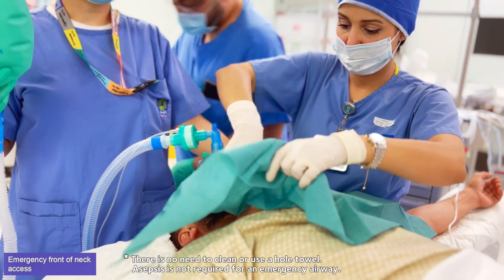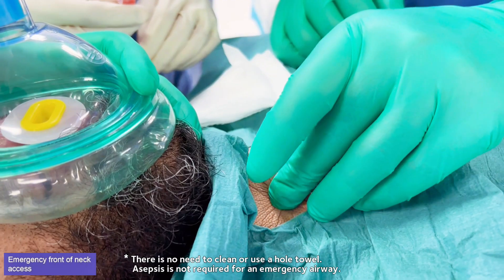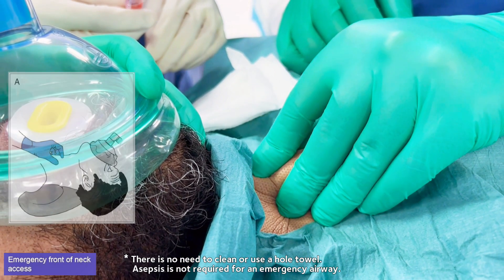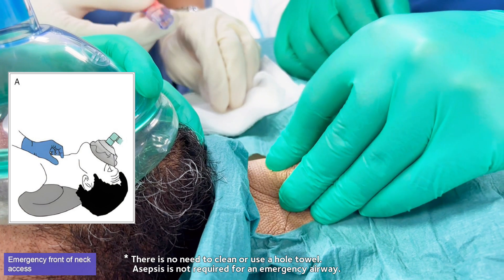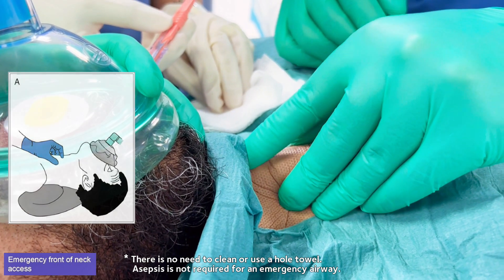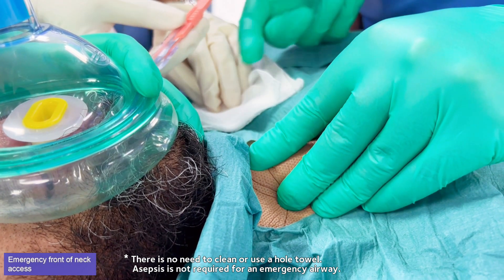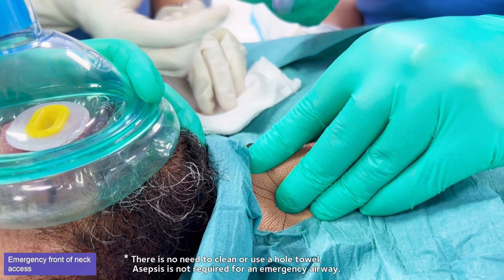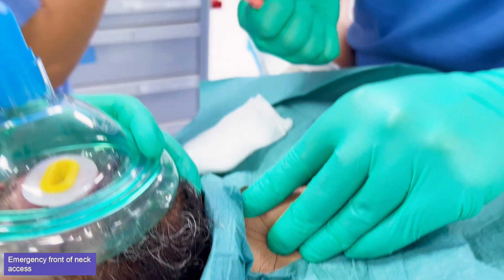Stand on the patient's left-hand side if you are right-handed. Perform a laryngeal handshake to identify the larynx. Stabilize the larynx between thumb and middle finger, stretch the skin, and place the index finger on the cricothyroid membrane.